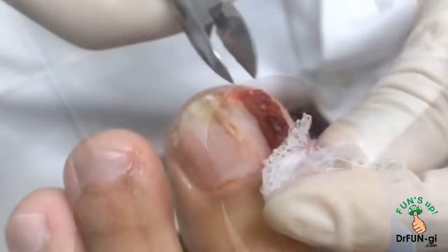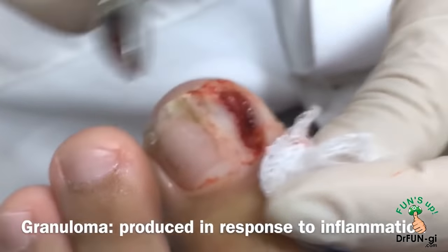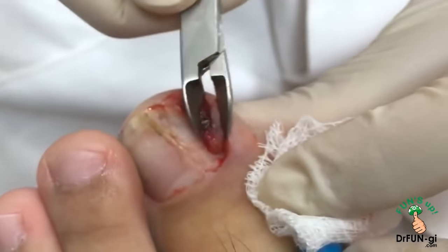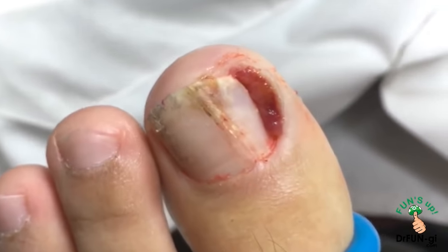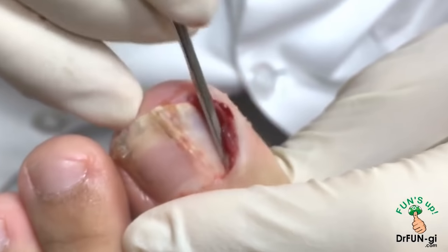That red tissue is called granuloma — it's a reaction of your skin to protect itself. It's quite bloody, so I don't want to take too much of it. But I'm going to have to take some because it's going to get in the way of doing the procedure. So I'm going to free this up a little bit underneath here.